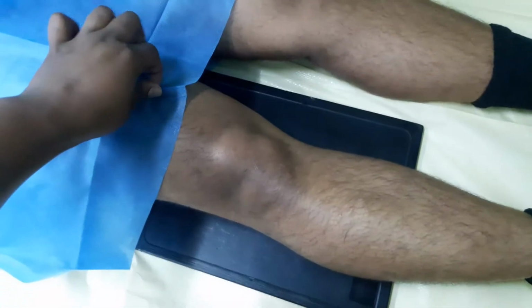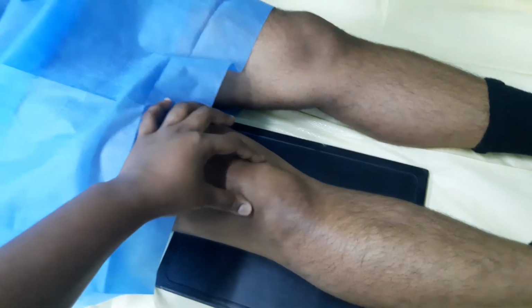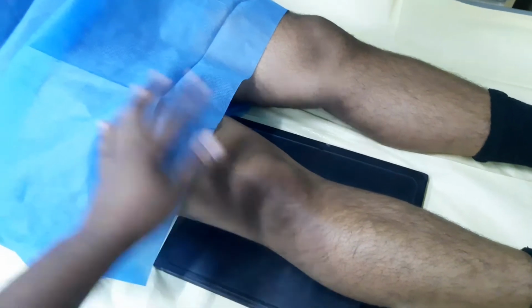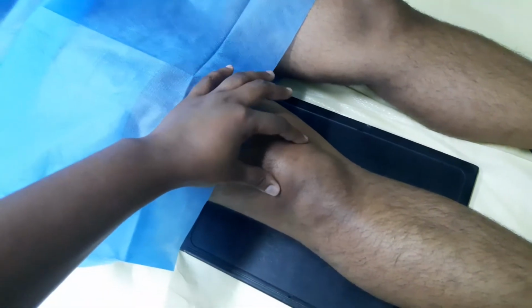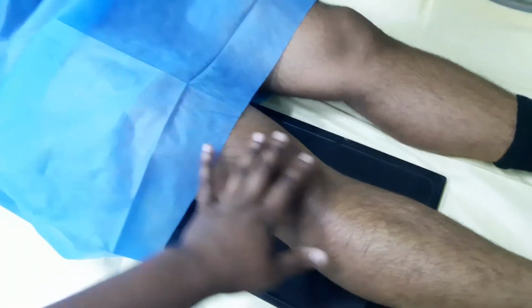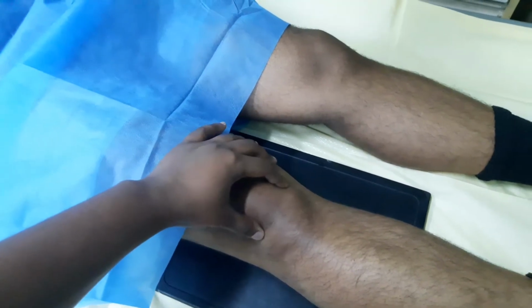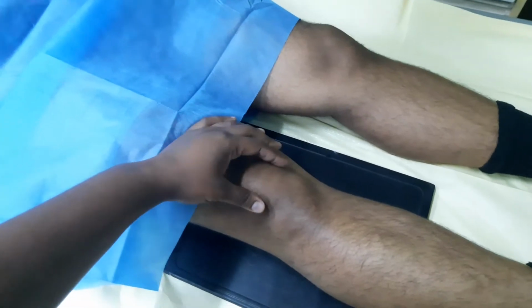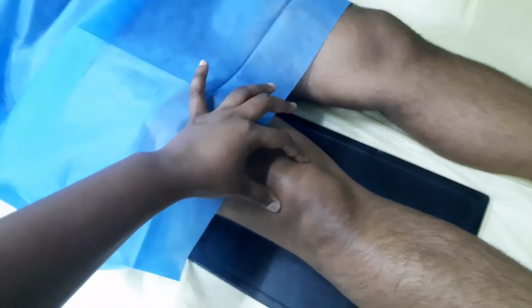So I'm just going to raise up the leg a bit, straighten the cassette or the image receptor, whichever you're using. And for the center for the AP knee, you want to palpate for the patella, because the centering, according to Bontrager anyway, or in general, is a half inch distal to the apex, which is the bottom point of the patella. So what I do sometimes, because some patients are bigger, and the knee area might be bigger than others, is press and feel, and you want to do this gently, because especially if they have knee pains, you don't want to go pressing and squeezing. So lightly you palpate. So I'm feeling the patella here.